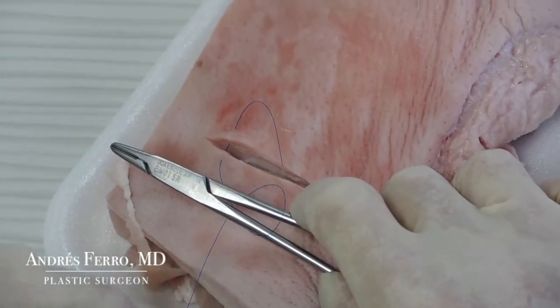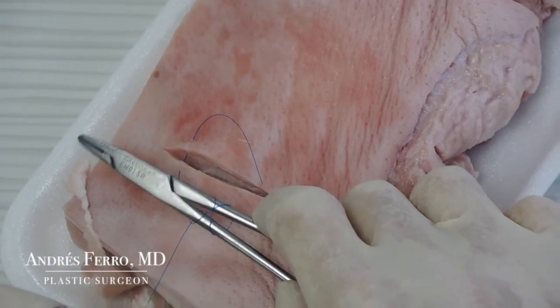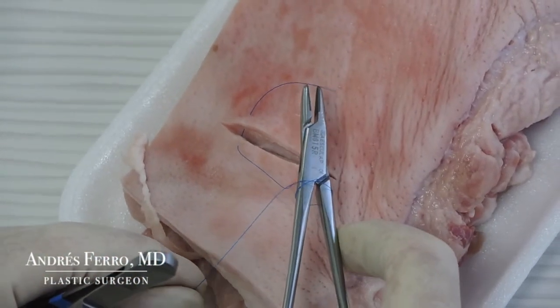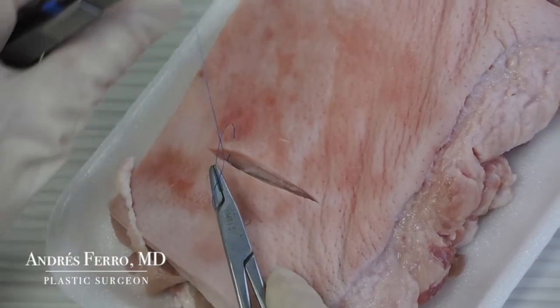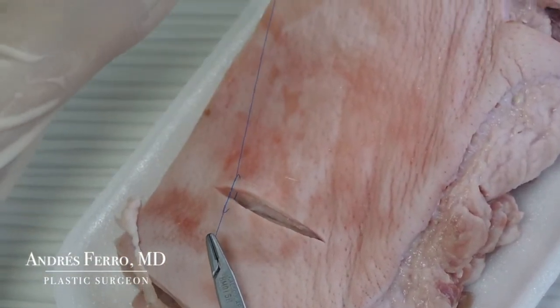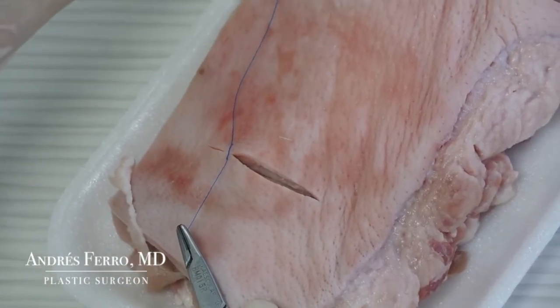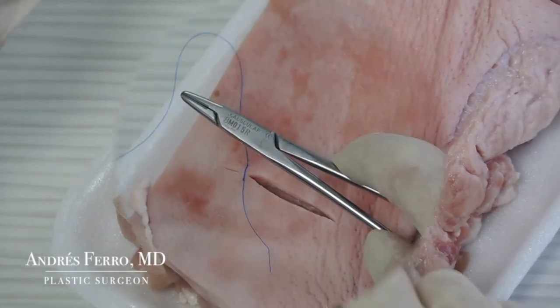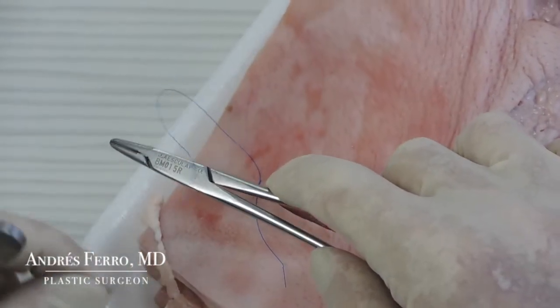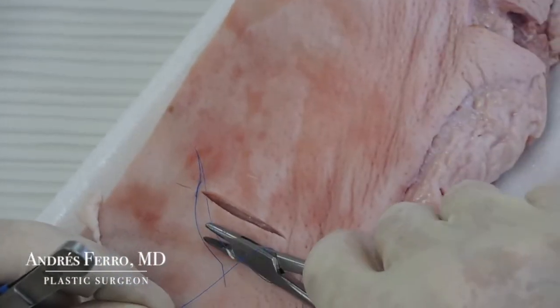To start knotting the suture, place your needle holder parallel to the wound and, with your other hand, give two loops forward on the needle holder. Take the distal end of the suture and tie the first knot until the tissue borders face completely. Again, place the needle holder parallel to the wound.